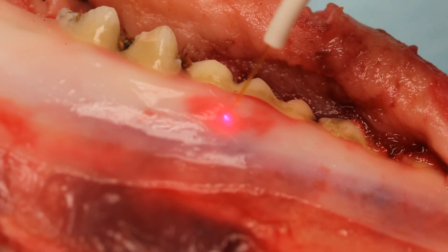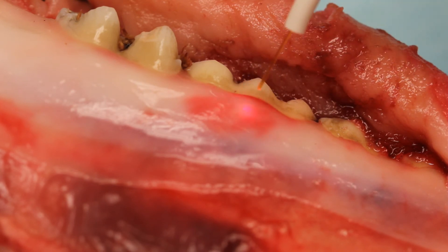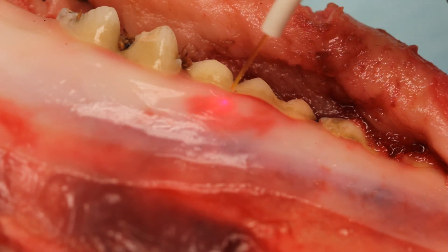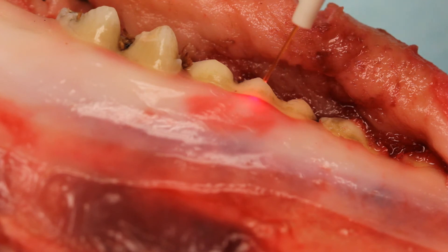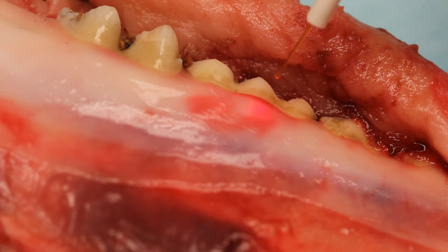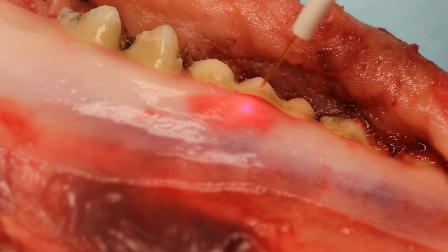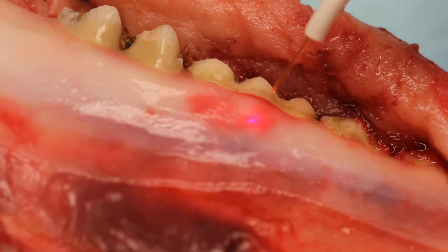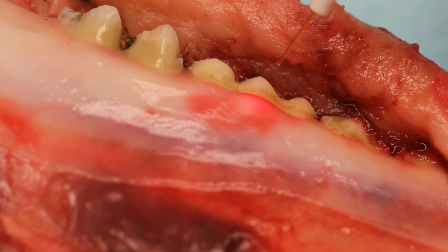There are two basic techniques to using the laser: non-contact and contact. For non-contact, as the name implies, you do not allow the fiber at the end of the tip to touch the tissue being treated. Once the laser is firing, hold the handpiece so the fiber is about 2 to 3 millimeters above the tissue. Slowly move the tip from side to side in an even motion to expose the tissue to laser energy. After a few seconds, stop and examine your work. The operator's manual contains a table of settings for numerous procedures and indicates whether a contact or non-contact technique should be used. An example of a non-contact technique would be treating an aphthous ulcer.